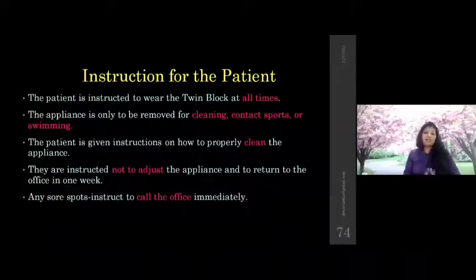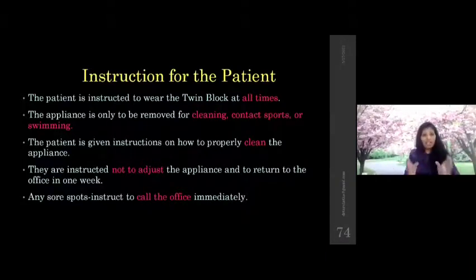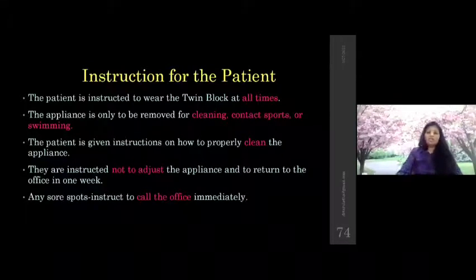And they're instructed very clearly that they should not do any adjustment with the wires or the acrylic. If they have a problem, let them call us. We can give them an appointment, but unless instructed by us, let them not touch the appliance. So these instructions need to be given on the first day, and you will ask him to visit after 7 days.